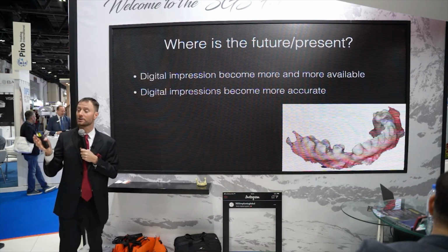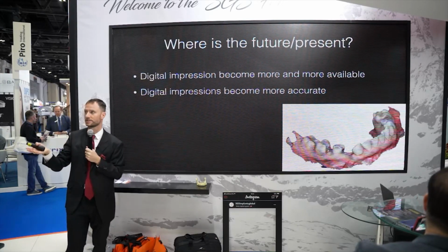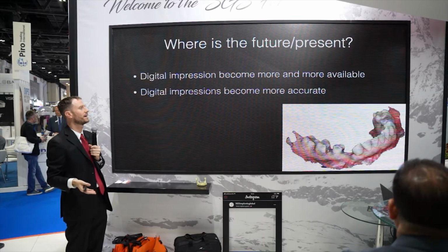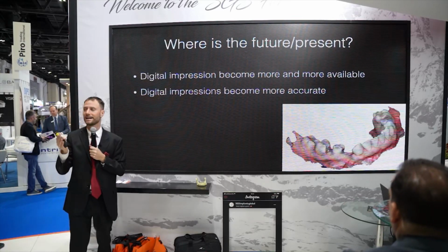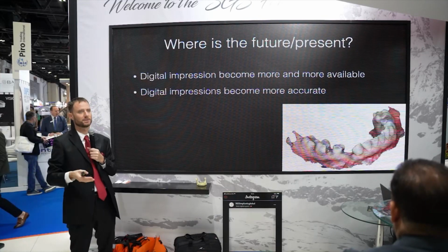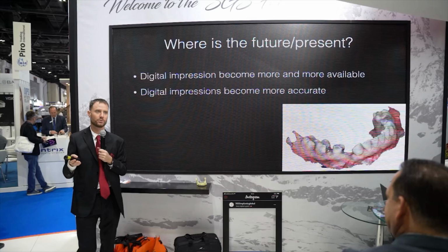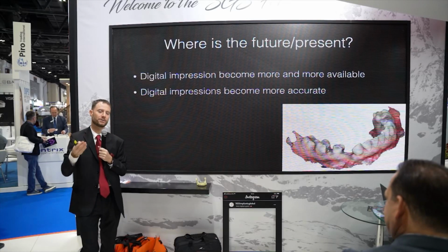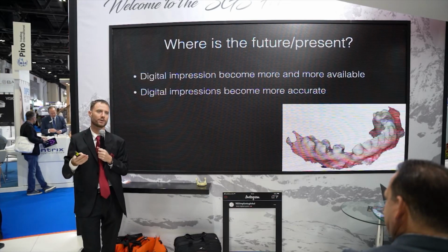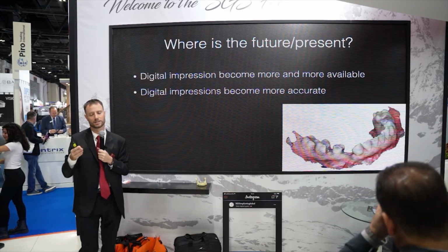And then we go for the other question I already raised, which is how you get the STL data, because you can do the CT as we discussed, but you can also get the STL data. It's good for the guides, but also very good for the restoration prosthetic part. Now more and more labs have the digital workflow. So what you need to do from your side is to enter yourself. You don't need to send any more impressions. You can, but you don't need to. You can do the digital impression.